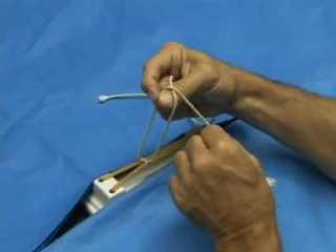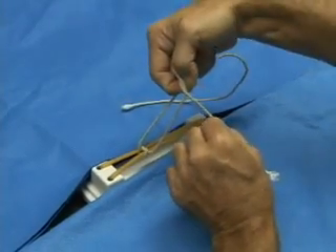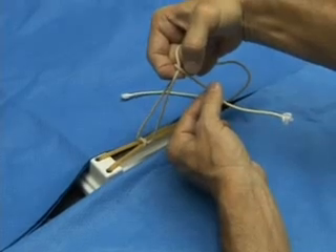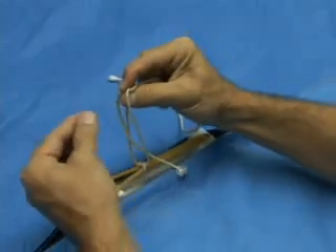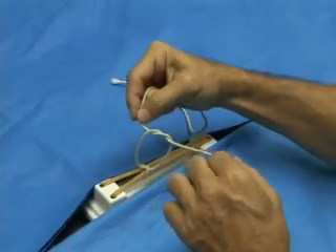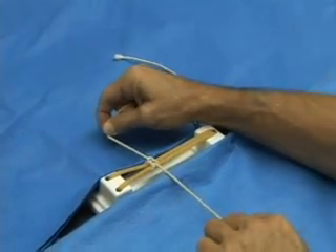Once again, pinch thumb and forefinger together. Pass that through the loop and use that to grasp the string that's in our left hand and pass it back through the loop like that. And when we take that down, we have a square knot.